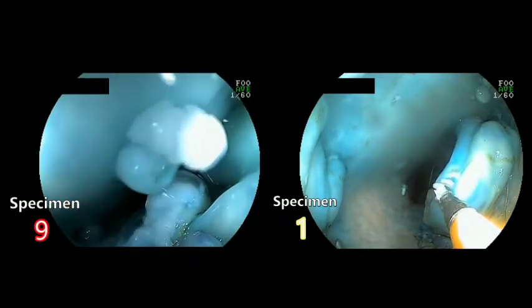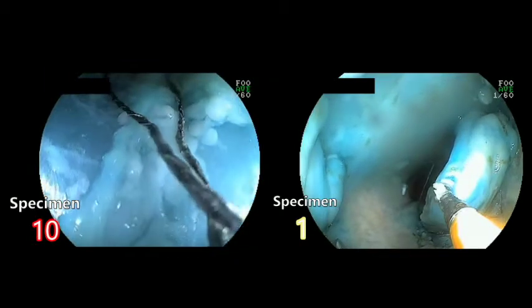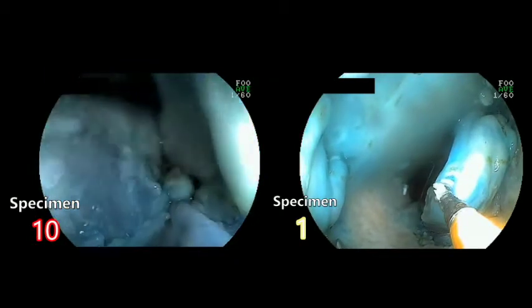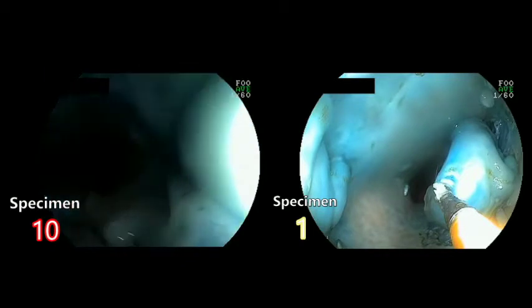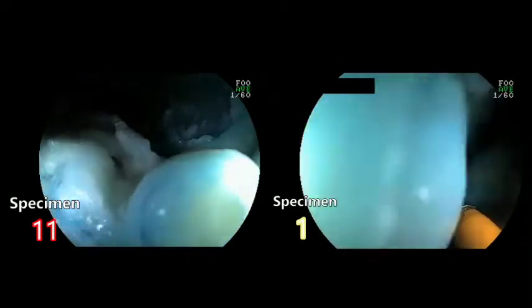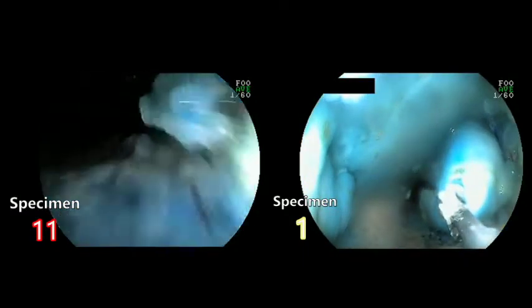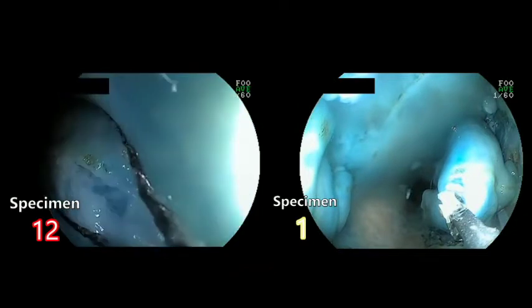Once this happens, the snare is then looped off the end of the endoscope and placed and positioned around the margins of the incised polyp. At this point, the snare is appropriately positioned and the grasper can also be manipulated in order to ease the tissue into the snare noose.